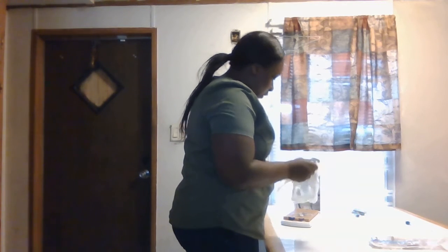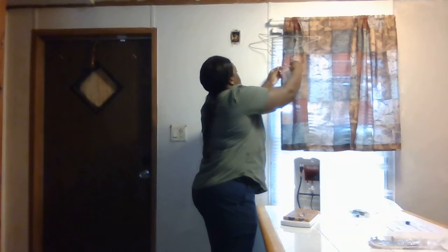Check the expiration date. Check the order that this is the right fluid that the doctor ordered. Is appropriate. Give it a little squeeze to make sure it doesn't have any holes in the bag. So I'm going to go ahead and hang my fluid there.